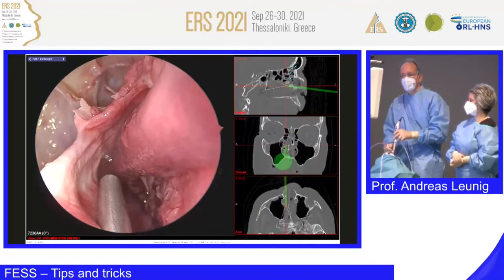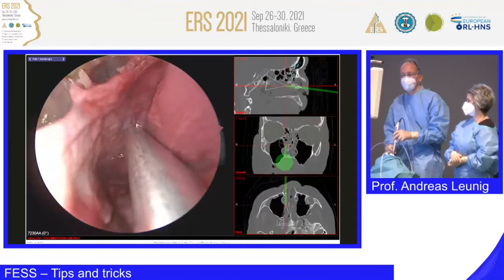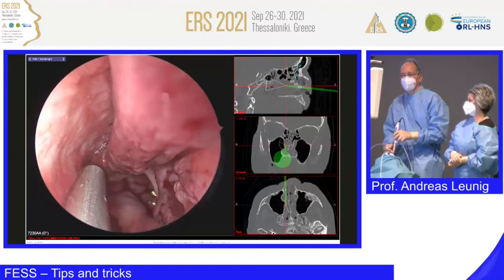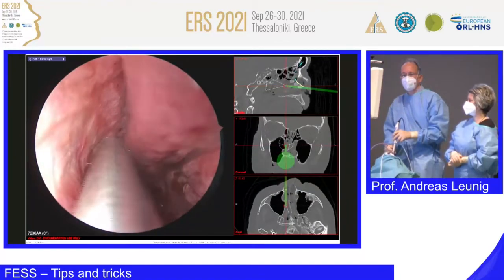And now, where to find the sphenopalatine artery? When you go in and you are looking for the posterior end of the middle turbinate, you will find around here one or even more.